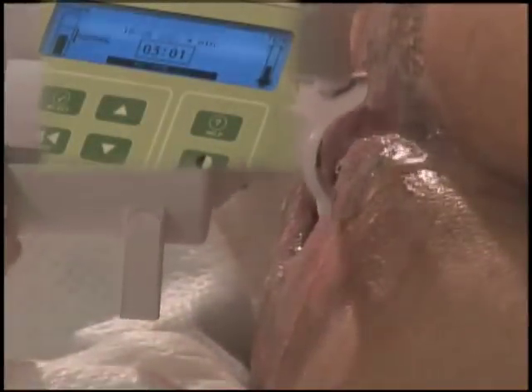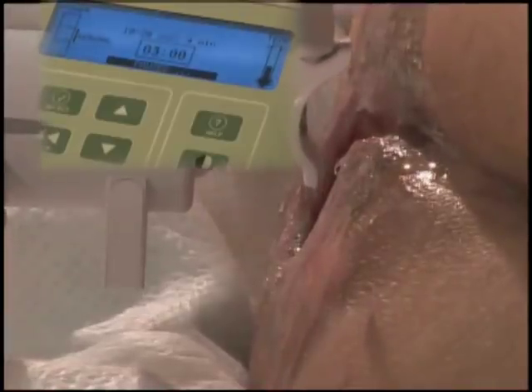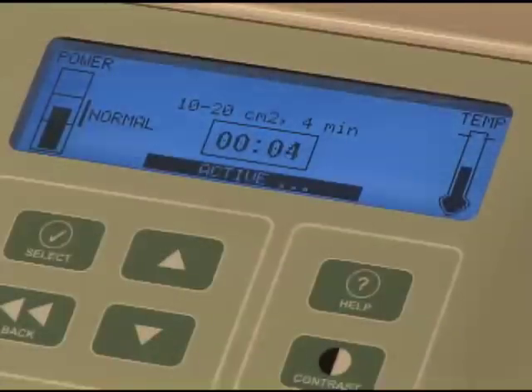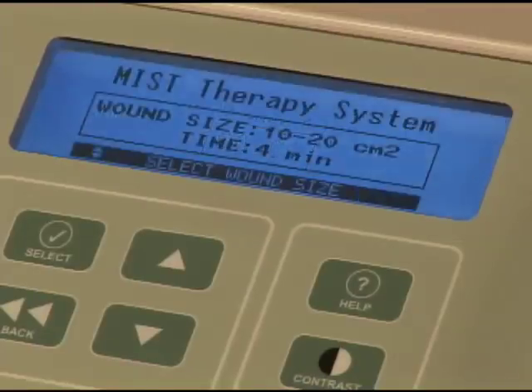You may pause the treatment at any time by pushing the control button again and rotating the saline bottle to the off position. Continue treatment until you hear three long tones and the generator screen returns to the select treatment time mode. Once the treatment is completed, the ultrasound will automatically shut off.